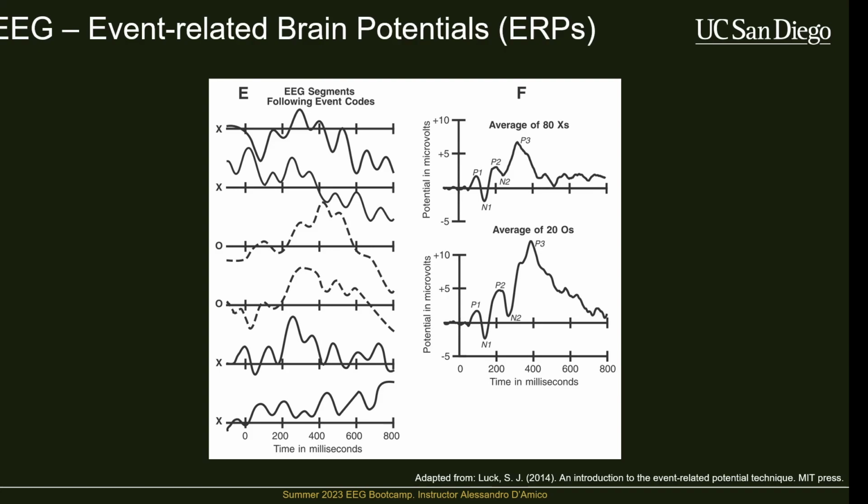But it's becoming more popular now with more continuously recorded, naturalized studies. Let's say you're recording from somebody for 24 hours a day, and they're doing all sorts of stuff. It's difficult to label those events, but you still want to have some idea of when people's states change or if there are reliable patterns. So those are the contexts where these things are being experimented on the most.